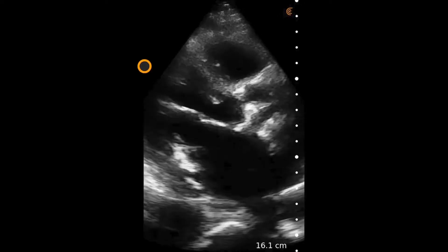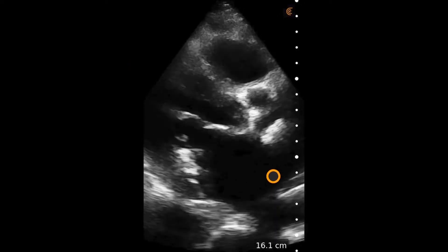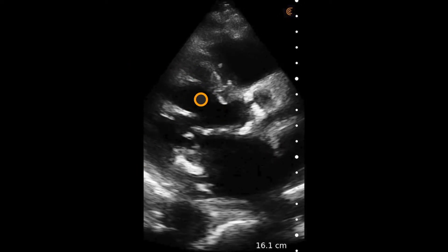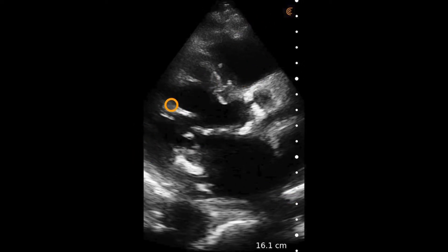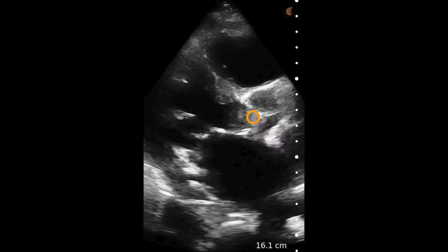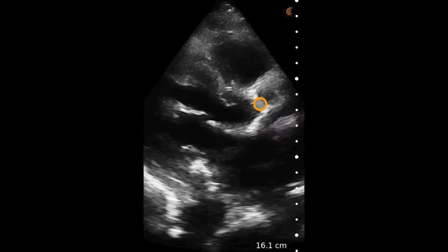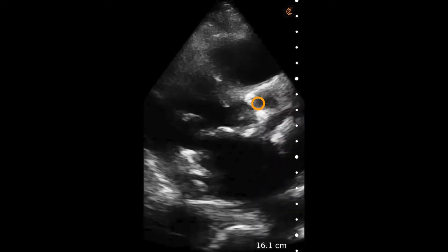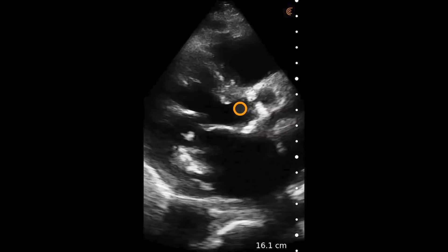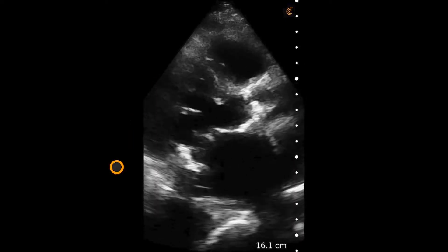Some notable findings, even in this suboptimal scan, are evident. First is dilation of the left ventricle, the left atrium, and the right ventricle, and impaired contractility of that left ventricle, signifying a reduced ejection fraction. This can also be evidenced in the mitral valve not coming all the way up to the septum. Also notable is sclerosis and likely stenosis of the aortic valve, which might be a significant contributing factor to this patient's symptoms.